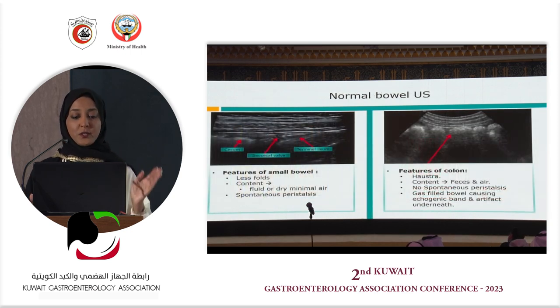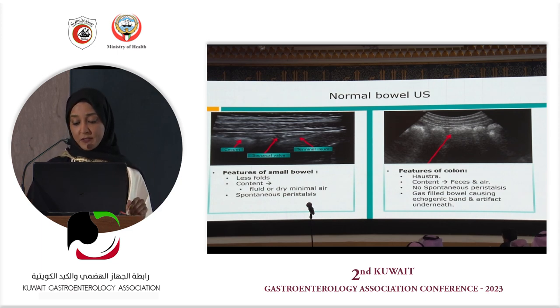Normally, the colon has haustration, as everybody knows, and it's full of air and stool, and it's still, it doesn't move, and it has an air artifact, so we can only visualize the anterior wall. However, the small bowel is mobile, it has fluid, and it has some sort of peristalsis.